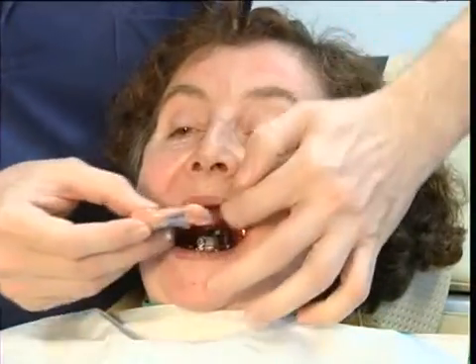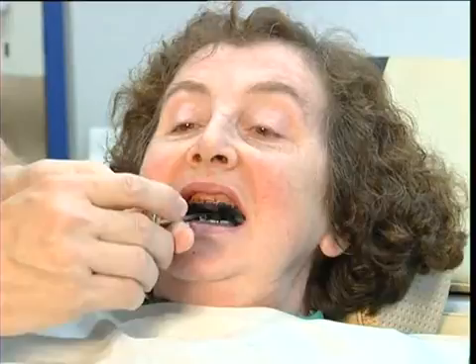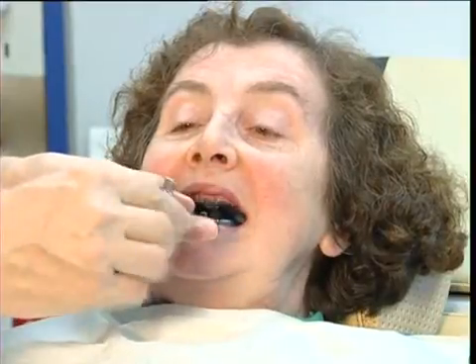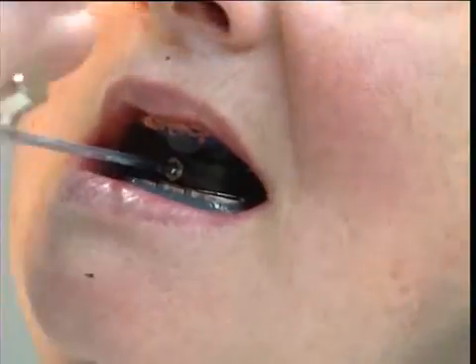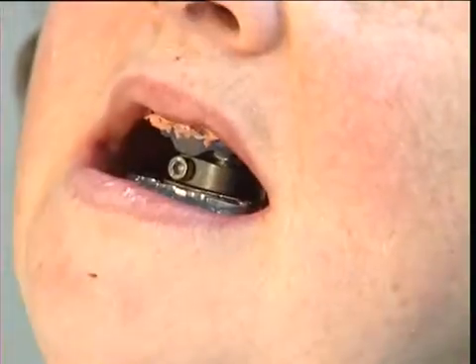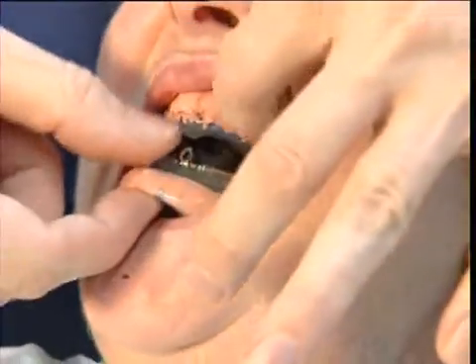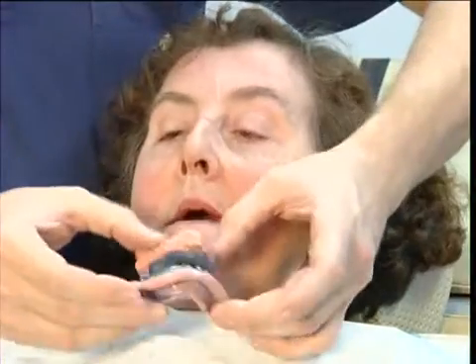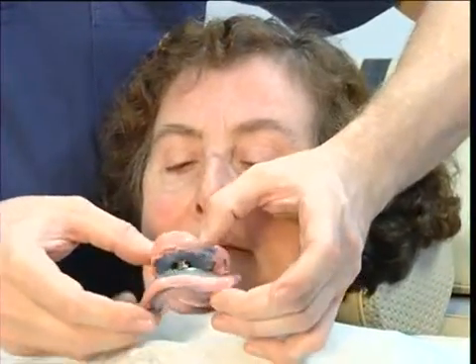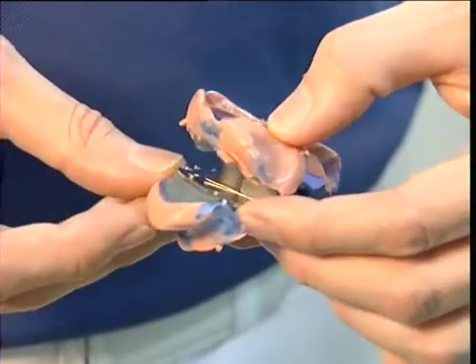Once the lower tray has been prepared, it is replaced in the mouth together with the upper tray. The patient is requested to close the mouth. If the registration was accurate, the tracing ball will enter the holder in the alignment clamp precisely. Once the jaw relationship has been established, it is locked with a universal wrench. Locking the clamp fixes the tracing ball three-dimensionally. This technique does not require irritating bite registration materials.